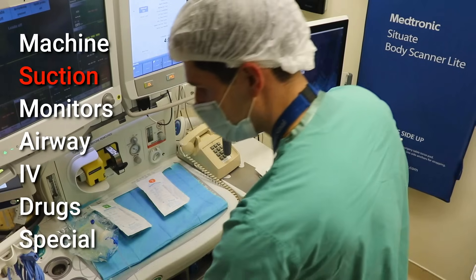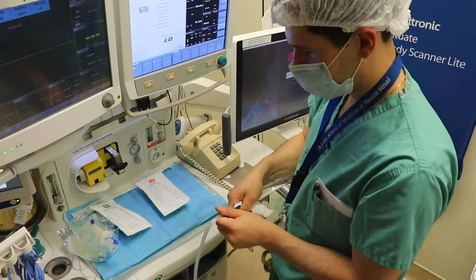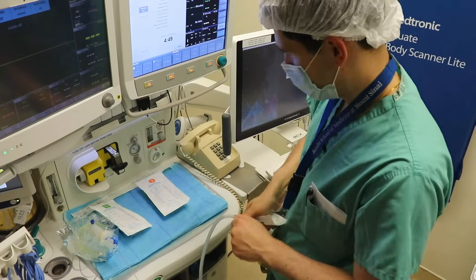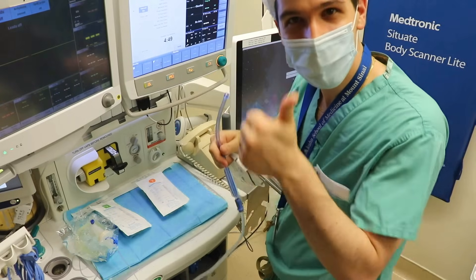Next up is S for suction, which is a simple and quick part of the setup but definitely not to be overlooked. They say the two most important things to save somebody's life are suction and an Ambu bag, which I'll get to soon. The suction works.